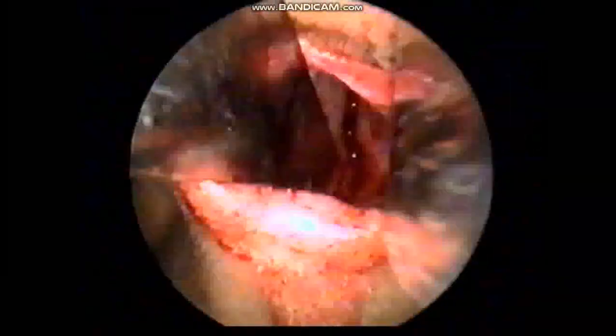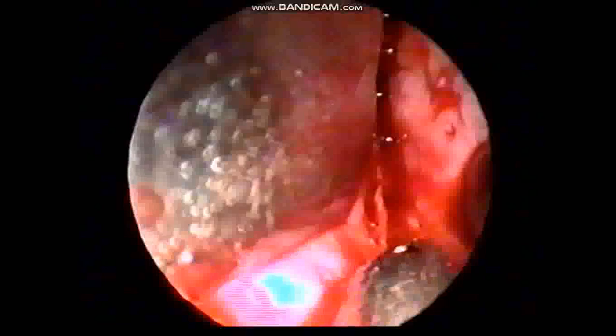The incision is made near the anterior nasal spine and on the upper surface of the maxillary crest. Now we would like to separate the mucoperiosteum on the maxillary crest. So make a good incision from front to back on the superior surface of the maxillary crest. Again, the blade is held in the upward direction, otherwise it will give a painful scar on the vestibule. Once the incision is made, using a mucoperiosteal elevator you separate the mucoperichondrium. There you can see the mucoperichondrium being separated on one side of the maxillary crest. The maxillary crest is clearly seen with a groove in between.